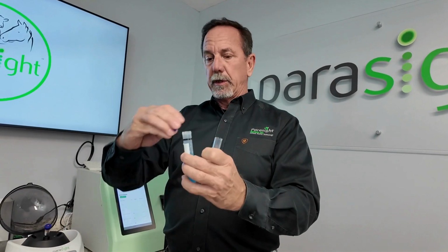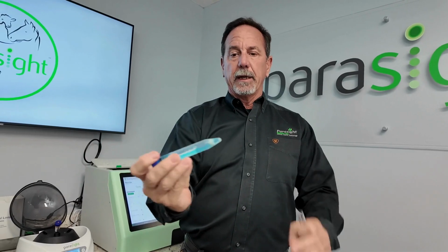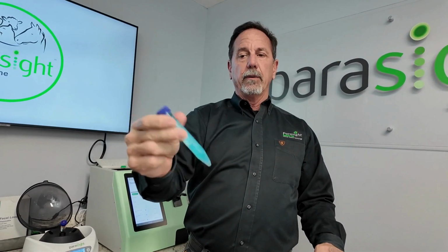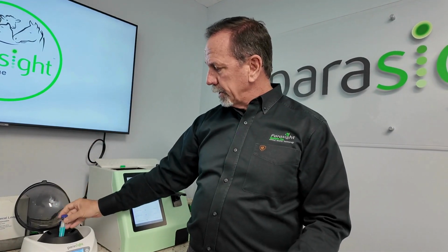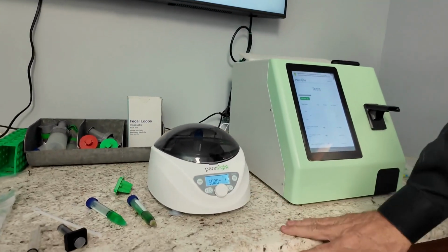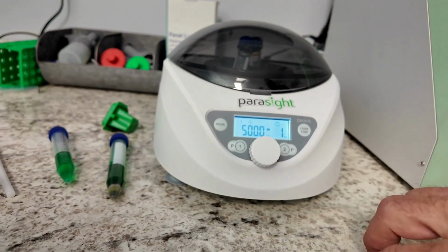And then what you'll do is you'll go ahead and close that. You still need to shake it because the little ball in there will help free those eggs. And then remember, we put it into the centrifuge, and we will go ahead and start that centrifuge, and we'll run it for 1 minute at 5,000 RPM.